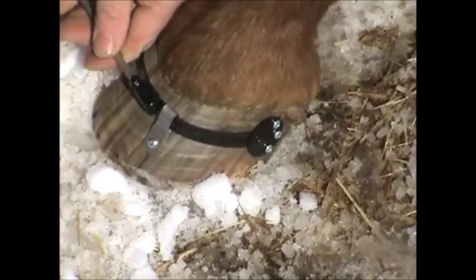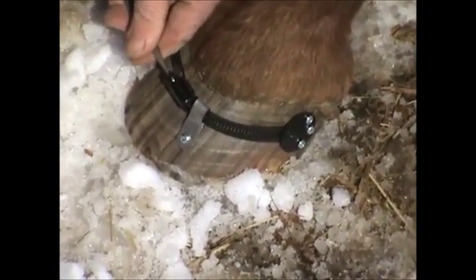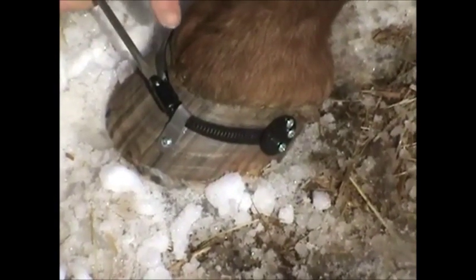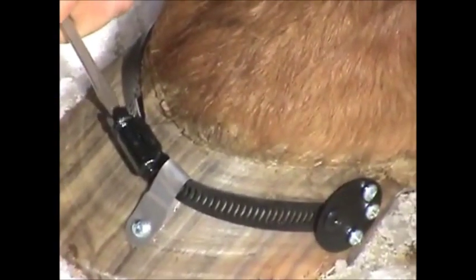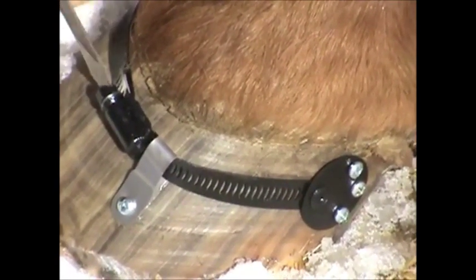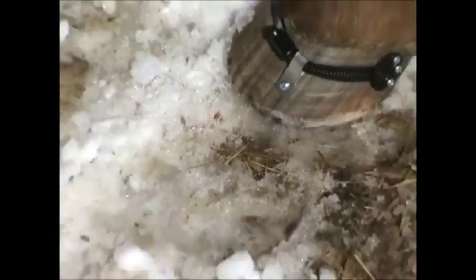Let me get these snugged up and then I'll start to move the hoof wall here — see if we can work up pretty steep on this one. You can actually see it right in here. See it move? And it doesn't hurt him at all. He does have a space. That's all we're going to do — as far as we're going to go. You can actually physically see his hoof wall come back in. Now we'll hold that pressure there and it'll force the hoof wall to grow back to the bone.